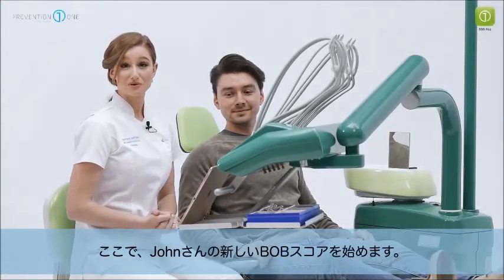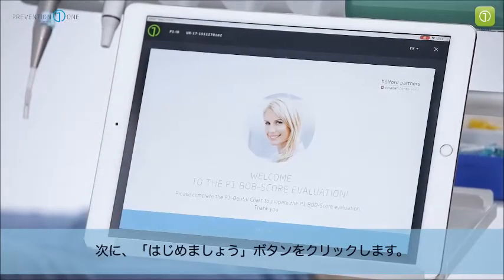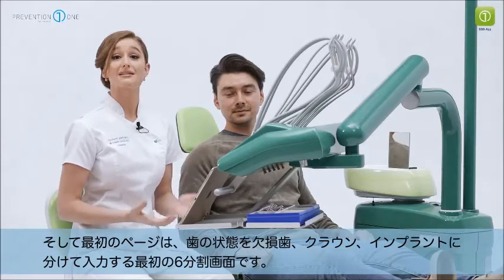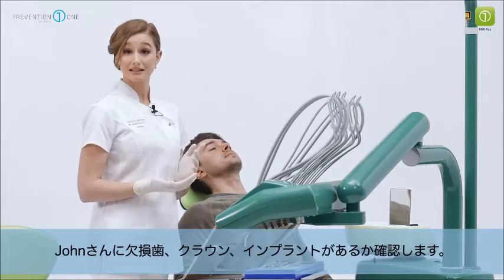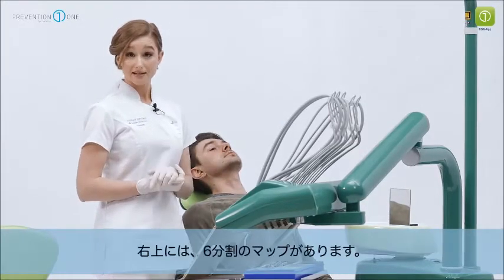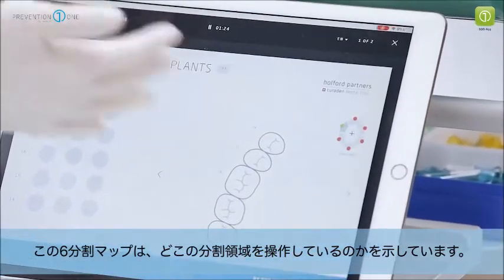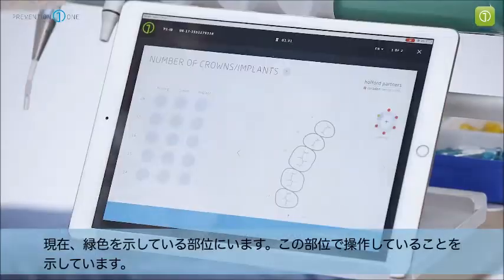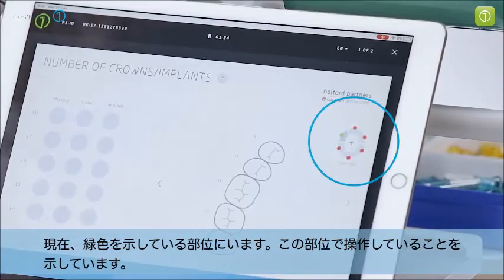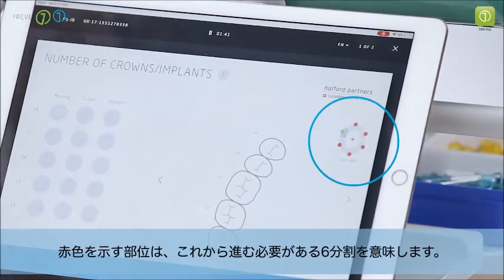Now I will start a new Bob score for John by clicking the play button in the top left hand corner. I'm then presented with the let's go button, and the first section is where we place missing teeth, crowns, and implants for John. To begin I'll have a look to see if John has any, and the sextant we start on is the top right. In the top right hand corner of the Bob app there is a mouth showing six sextants — the green area indicates the sextant we are currently working on, and any areas showing red are sextants we still need to complete.